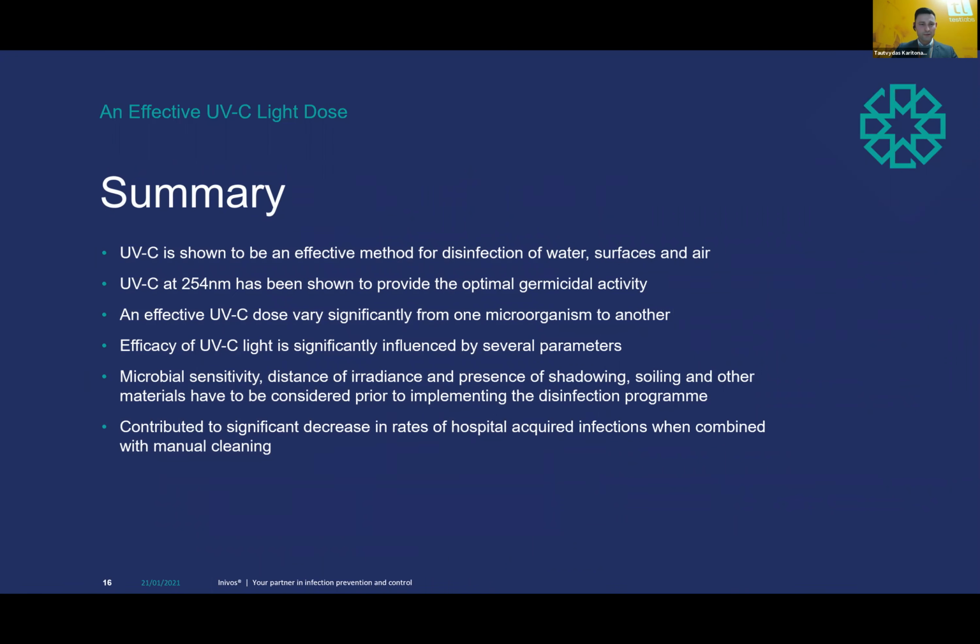So I suppose to summarize, UVC is shown to be an effective method for disinfection of water, surfaces and air. And there's no denying, and it's good to see, that more industries are employing the technology. I think what we have to make sure is that we use the right technology with the right parameters to make sure that 2025 still sees UVC light as an effective way of fighting against bacteria, rather than contributing to the massive amount of bacteria that become suddenly resistant to UVC light.